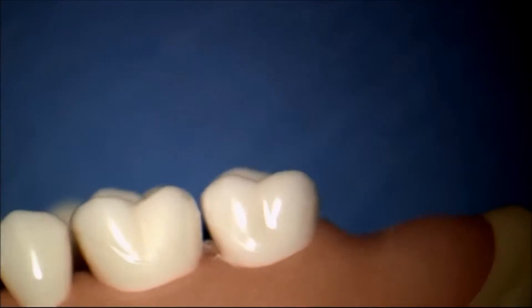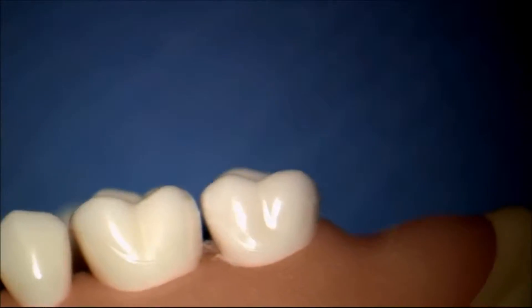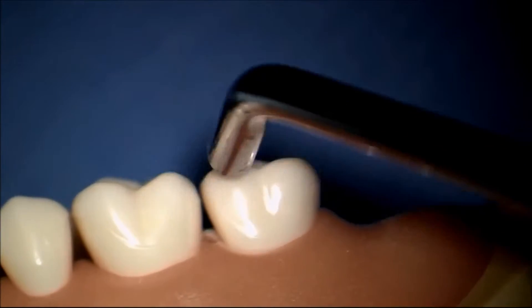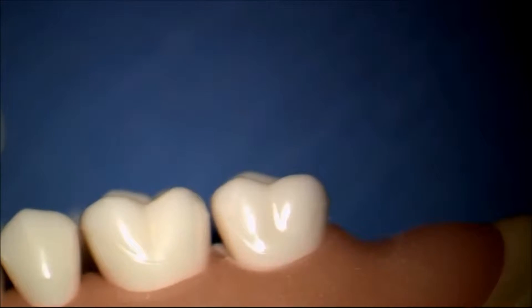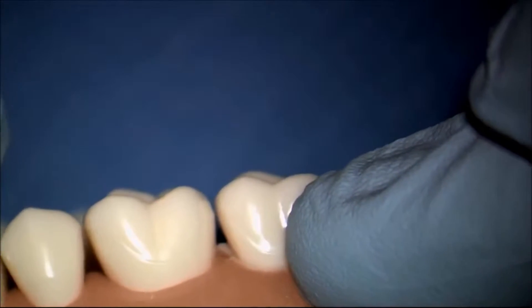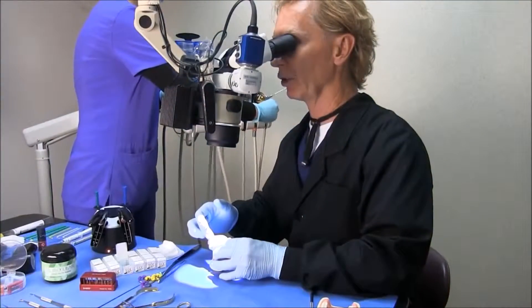Now let's take a look at that contact. We have flattened the contact — there's a much larger contact now. It's no longer invading the space of the neighboring tooth, which often happens when we have a little bit of crowding. That contact is now going to be much better and much more in the middle of the tooth.